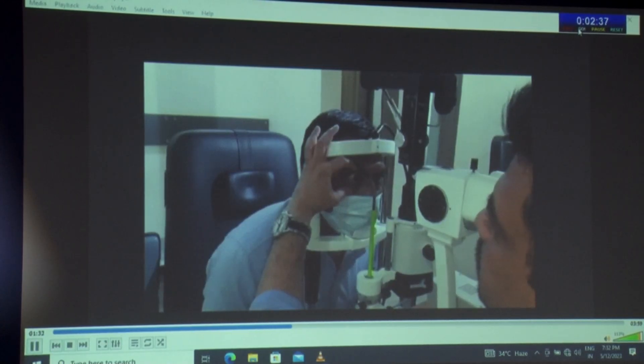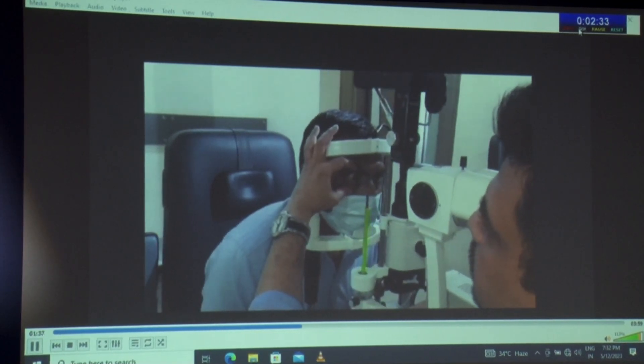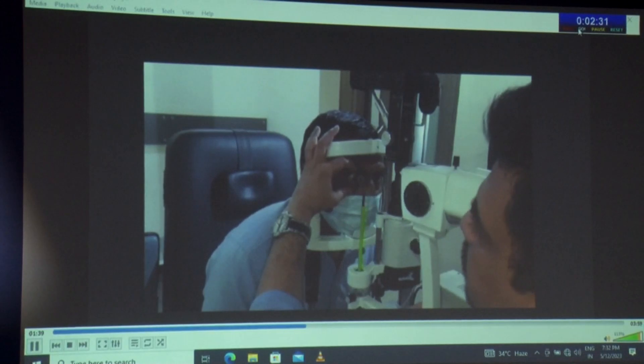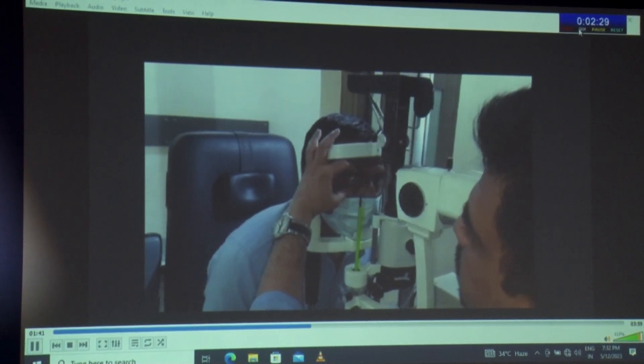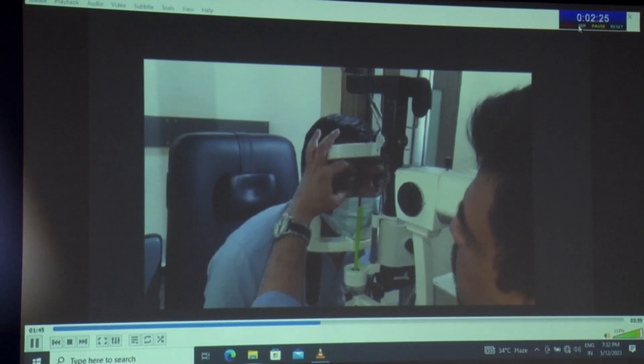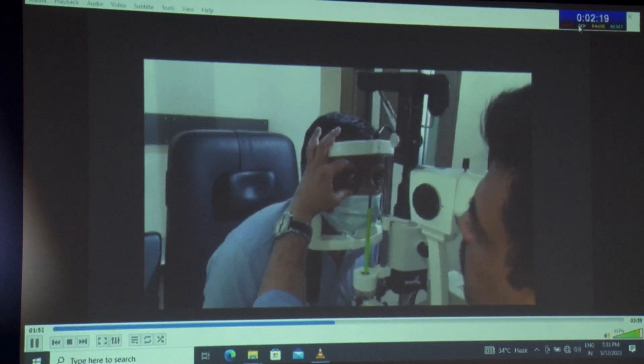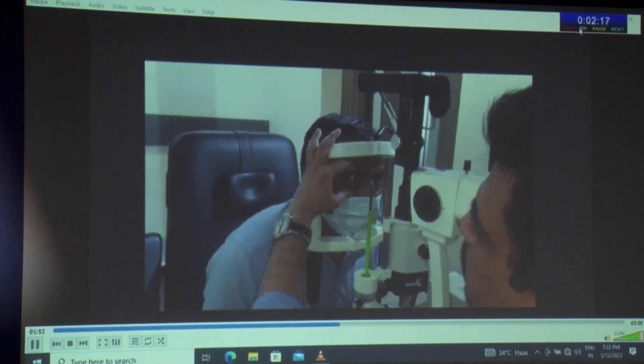Coming to the first prototype of our device — as you can see, we have inserted it into the calibration slot of the slit lamp. With the help of the knob of the slit lamp, we move it forward and it indents the cornea at the desirable axis. Again with the knob, we take the slit lamp back and it returns to its original position.